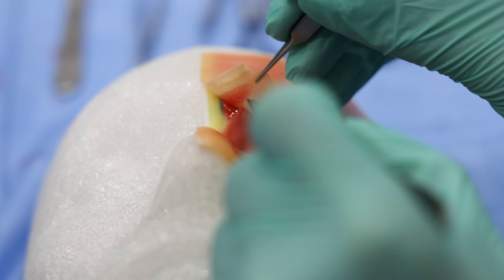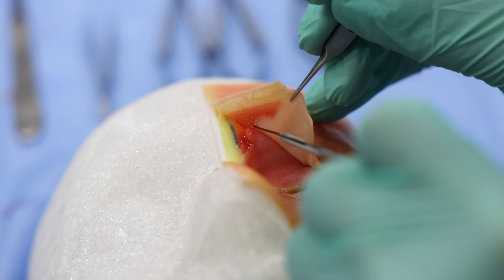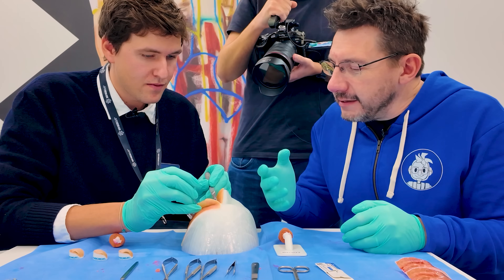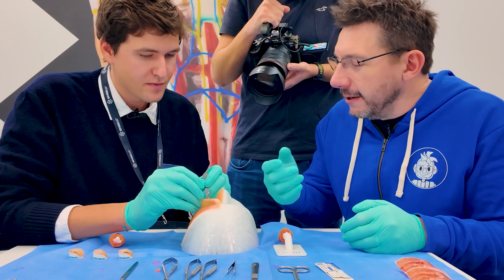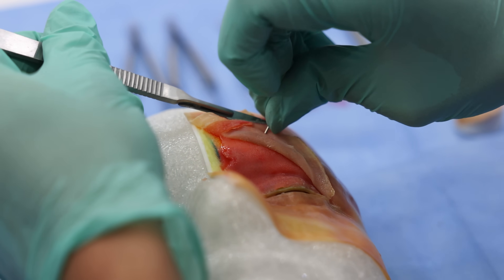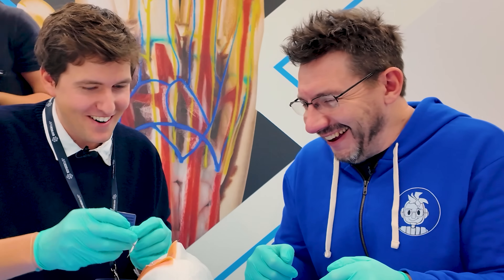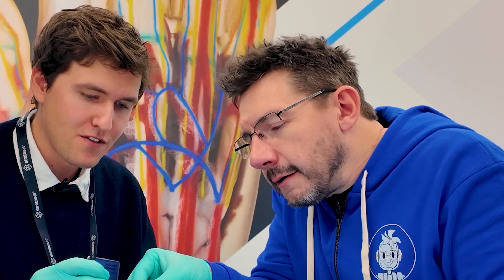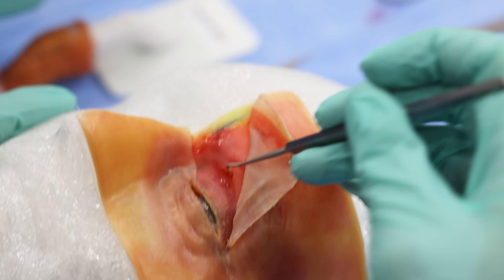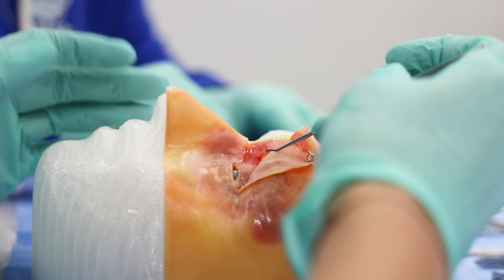Going underneath the muscle, you can find the blood vessels - there's some liquid we need to remove. The model actually contains material that maintains a liquid state to simulate blood in the tissue, so it's always the same consistency. You can then remove all the fat - you would have different tools in surgery to scrape it out - and you work through the whole process, maintaining and managing everything.